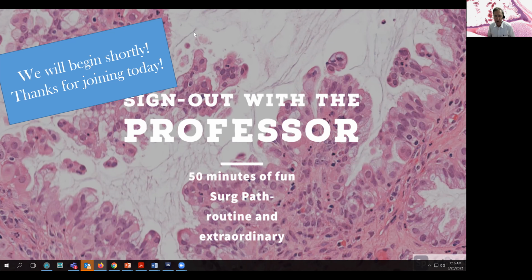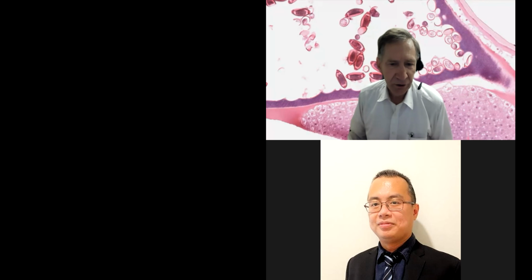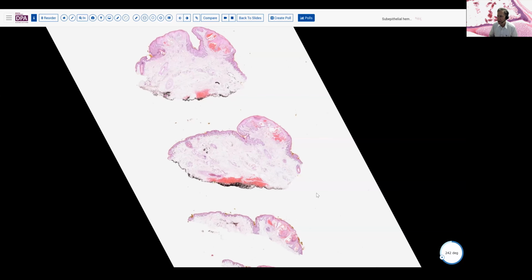So I'm going to switch screens here, and we will take a look at the slides. Our first case is from the realm of skin pathology, but last month we talked a lot about GI cases, and I thought that this month we would focus a little bit on some GYN cases and the lower GYN tract in particular. So can you all see my screen with the digital slide? Yeah, I can see it. Okay, very good.